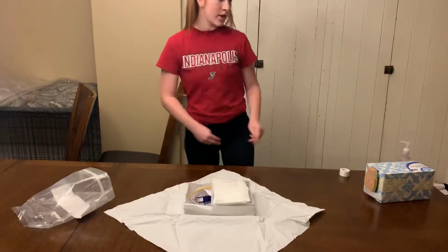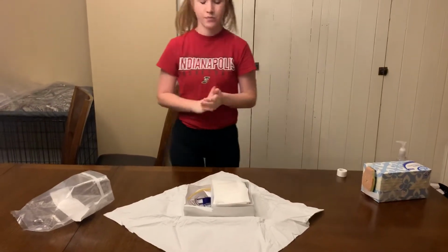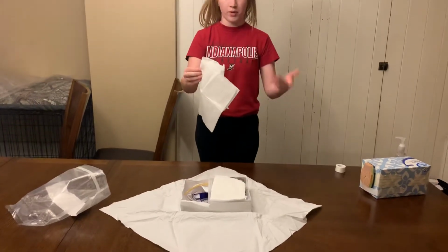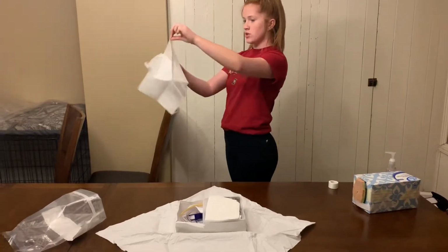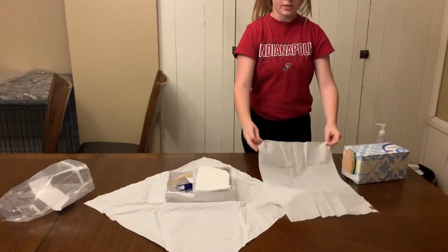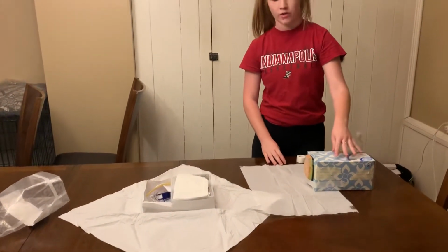Okay. So I'm going to go ahead and perform hand hygiene again before I touch any of this stuff. I'm going to place the drape first and then don my sterile gloves. So I'm going to grab my sterile drape to place under my patient. Trying not to cross over, but again, my table's not at waist height, so it is a little bit difficult not to. And then I'm going to open this, the shiny side towards me, touching just the outer 1-inch border, so that I can place this without crossing over. So then I'm going to place that, and I'm going to position my patient as if their hips were over top of the drape. In the clinical setting, it may help to have another nurse to help me do this.